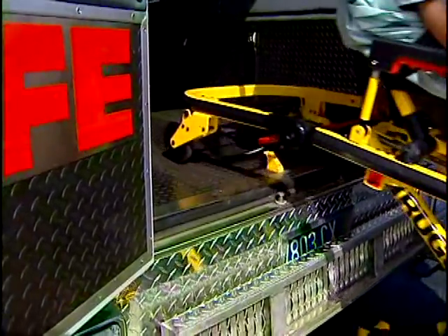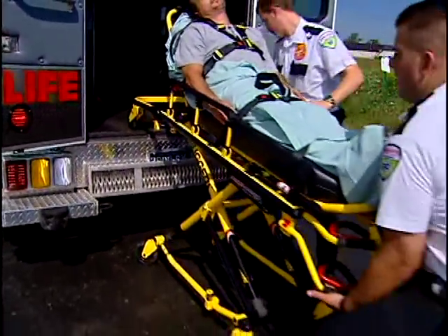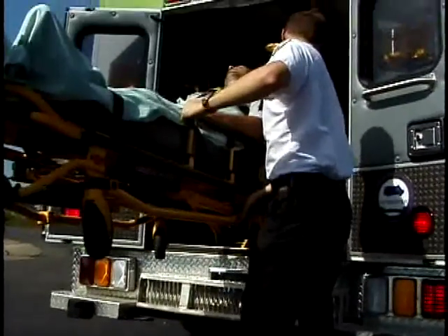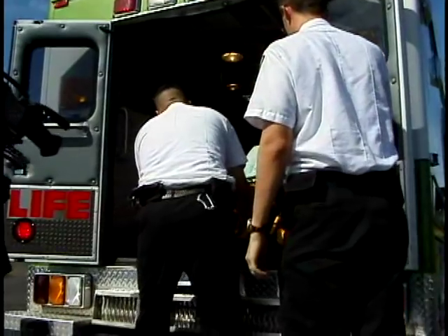Approach the back of the ambulance squarely. Move the safety bar over the safety hook, then back against the safety hook to raise the legs without hitting the bumper. Lift the cot and squeeze the release handle as the second operator raises the legs using the side rail for stability and leverage and helps guide the cot into the ambulance.